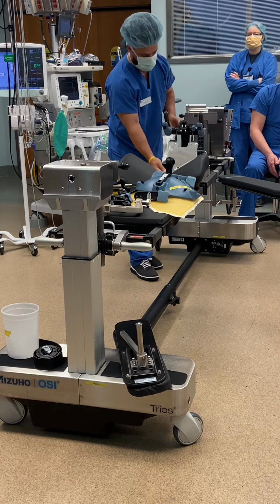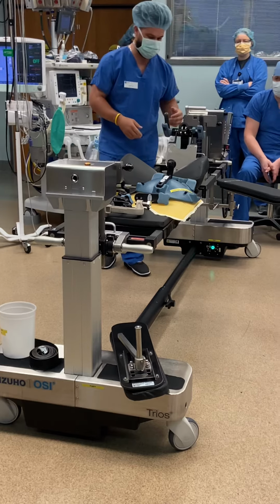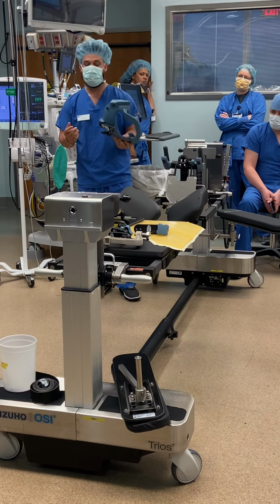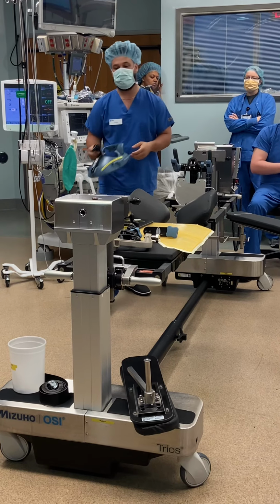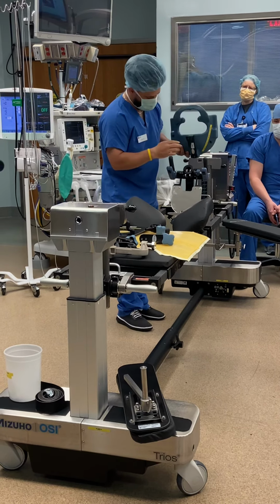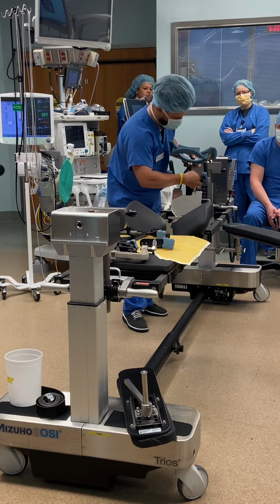We have a mirror here on the end for anesthesiology, just having a visible pathway to the face, making sure everything's good during the procedure. We have this first item right here. Anytime you're putting the patient in prone, you would set it up this way. It already has the cone attachment, which is nice. We do have the Starburst attachment for the other items, but this one already comes with it, so you don't have to do any extra work. It just goes into this little socket right here, clips right in, and then you tighten it with this little knob right here to the right of it.